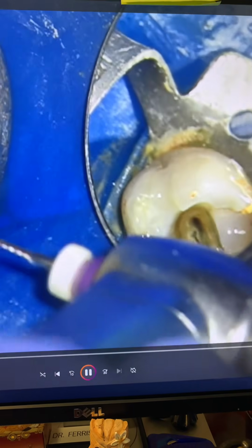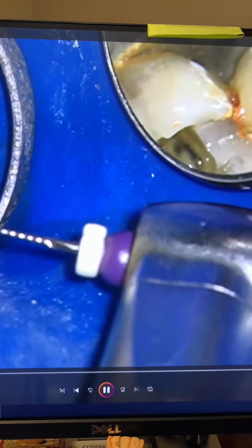So this tooth has 3 mesial canals: MB1, MB2, and MB3. And we're talking about tooth number 2, upper right, second molar. The chances of upper second molars having an MB2 is about 40%. And this tooth has an MB3 also: MB1, MB2, MB3.